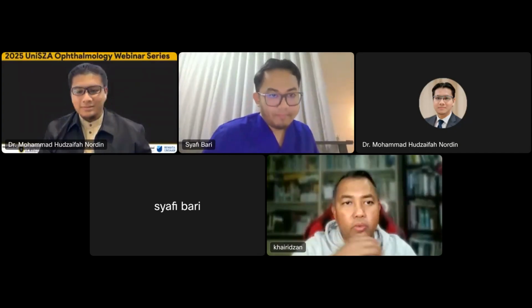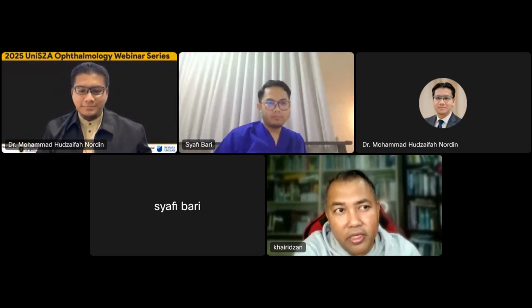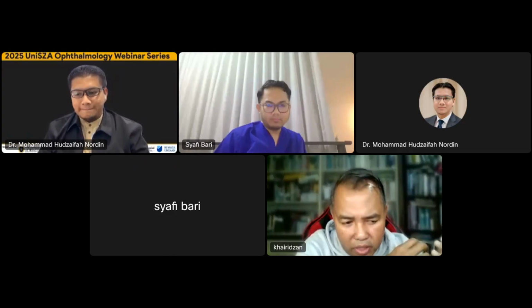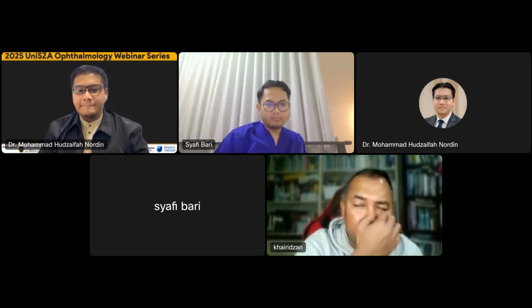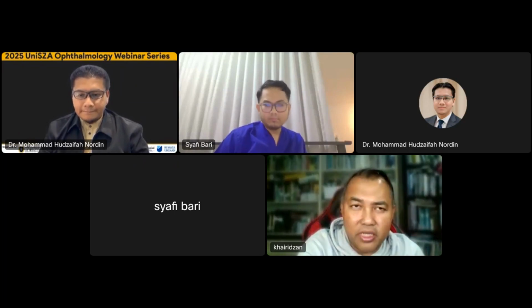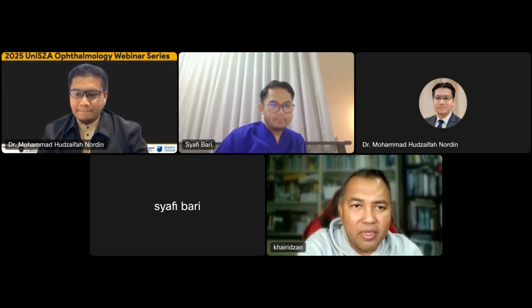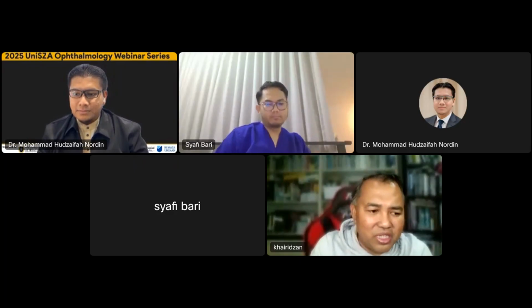Thank you so much, Syafi. Thank you, Dr. Hudzaifah. I think the most important thing for everybody to understand is actually the nature of the defocus curve. And the reason why this is important now is because almost everybody now claims that their monofocal lens has a plus effect. And this is where we have had an issue before, because the definition keeps on changing.